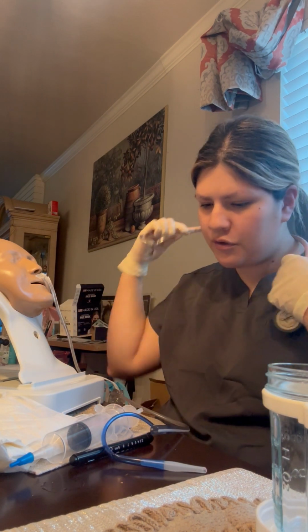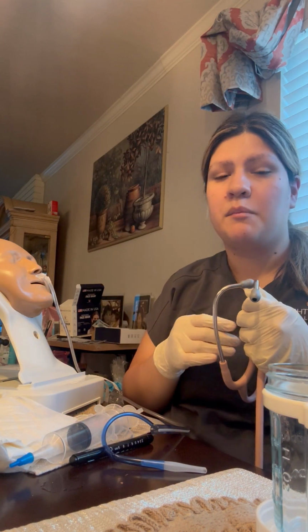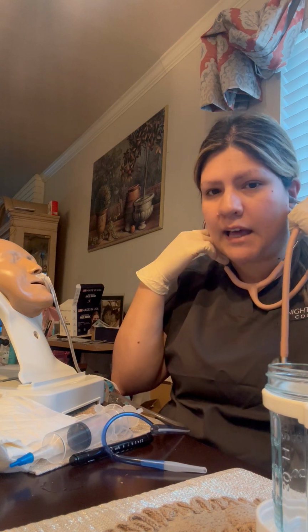So I will do both just for the contents of this video. Depending on what your doctor says, you can even check placement with an x-ray, but we'll get into that later.